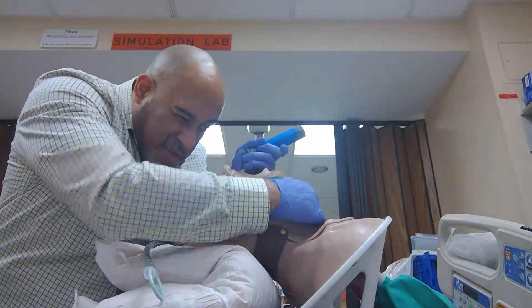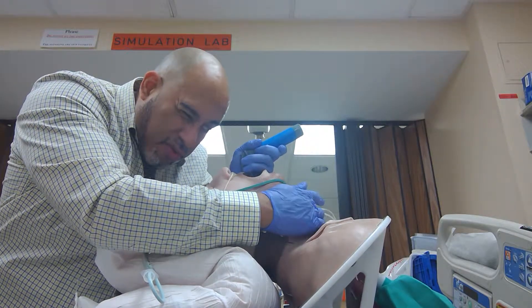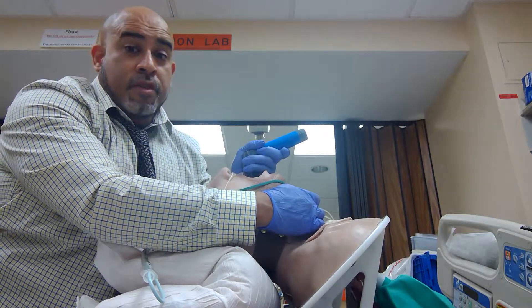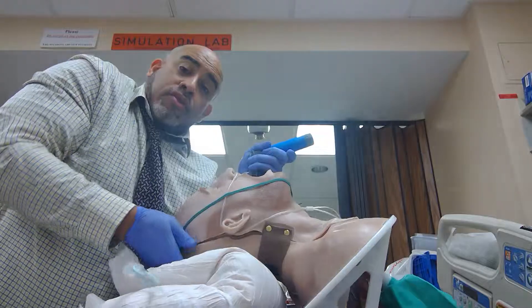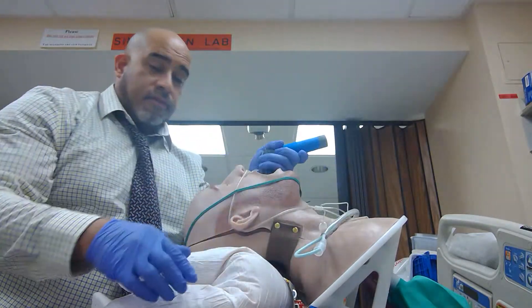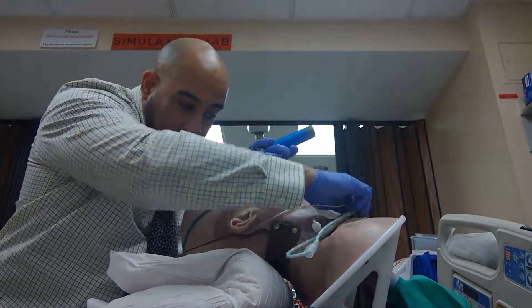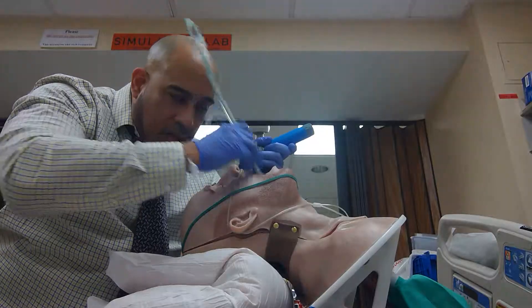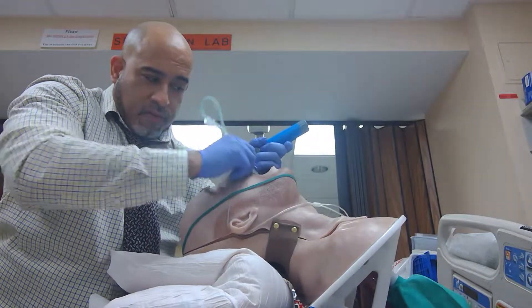See the cords — see more of the cords right there. If I had someone to do this for me, great; if I don't, I'm stuck. You can also use the BURP method, or if the patient was completely flat you can lift the head — but that's another video. Tip-up angled towards the cords.